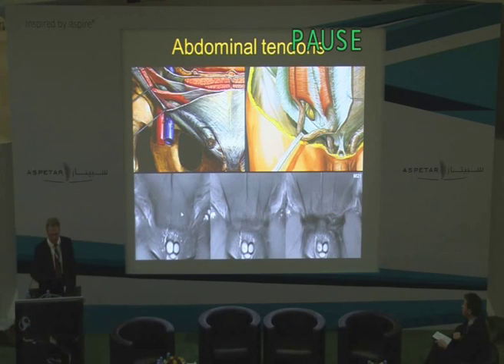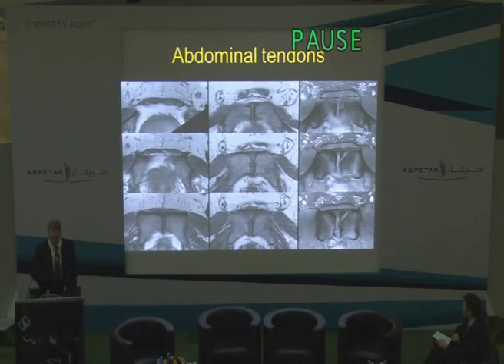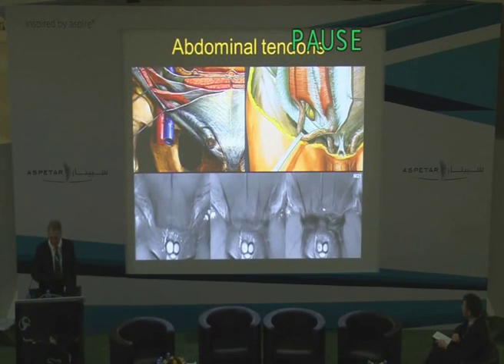And if we move from the pyramidalis muscles anteriorly to step back into these black cords, you'll see these black cords here. These are the tendons deep to pyramidalis which form a sheet that come down and fuse with the pubic plate and or the pubic bones. These are linea alba, rectus abdominis tendon, and this lateral cord is a very important one. This lateral cord is the conjoint tendon.